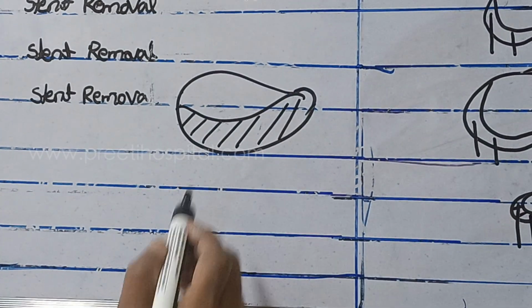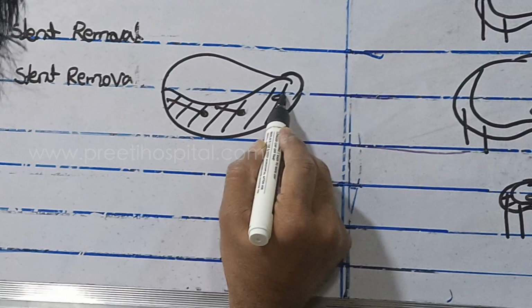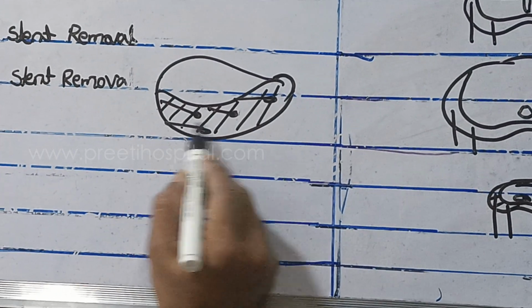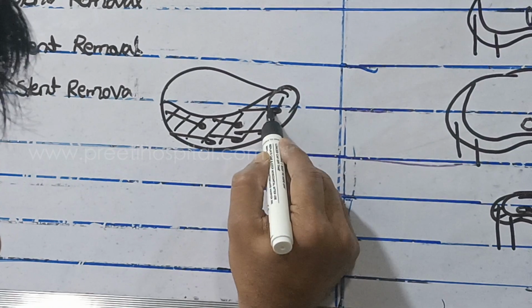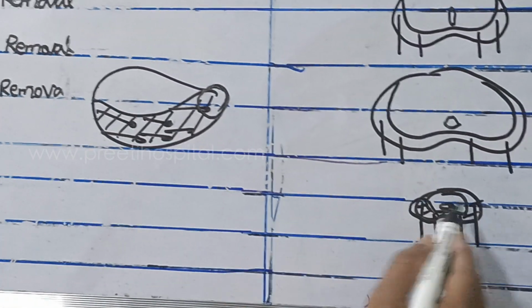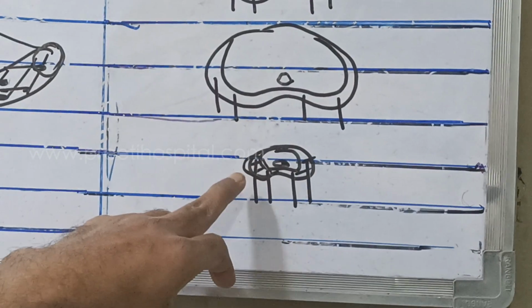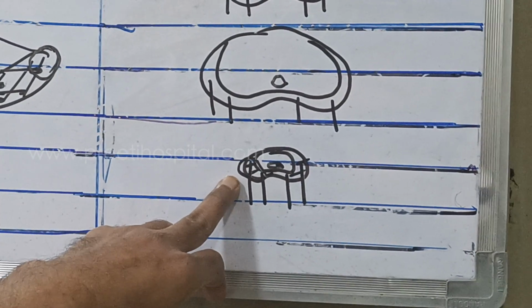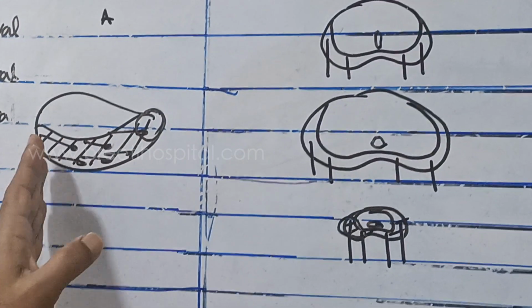This is all the peripheral zone. You start from here, go. You start from here, go. When you are taking here, significant part is missing, whereas here significant part is coming. So at the apical region, you will see more peripheral zone in the axial cuts. At the base and these regions, lateral.